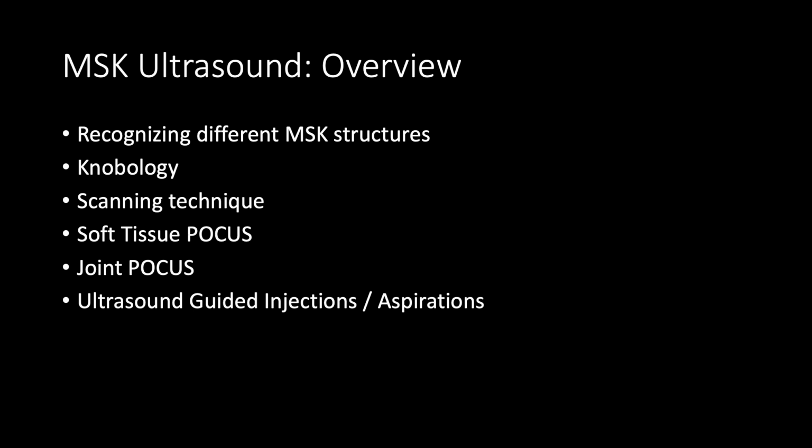I'll go over some of the common skin and soft tissue conditions, such as abscesses, phlebitis, cellulitis, ganglion cysts, dermoid cysts, foreign bodies, etc., and we'll have a series of videos covering the major points and going over common presentations and ultrasound findings for those conditions. We'll then end the module with a quick dive into ultrasound-guided procedures that you may want to incorporate into your practice.